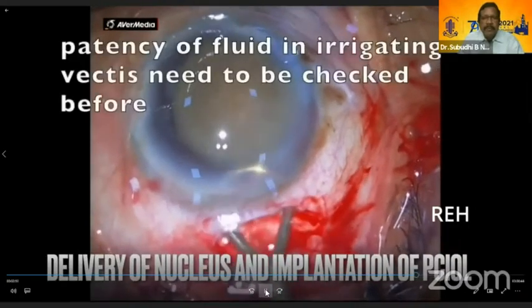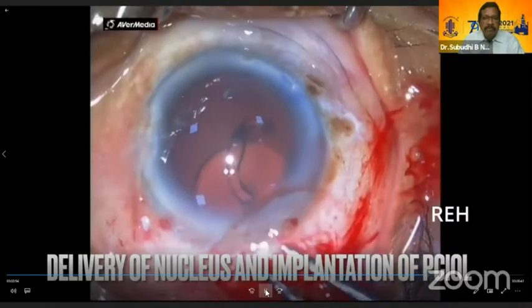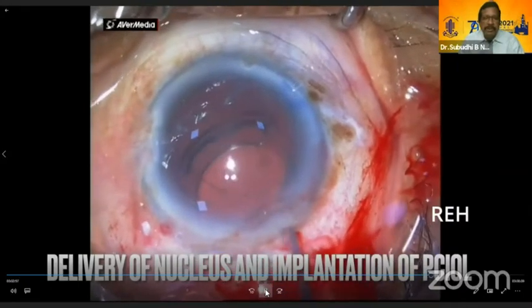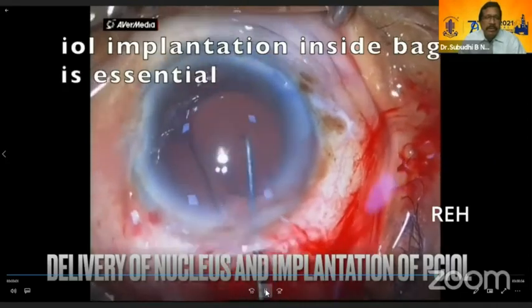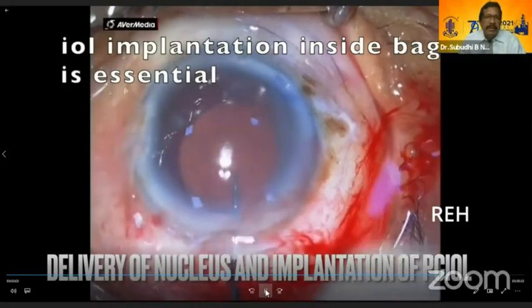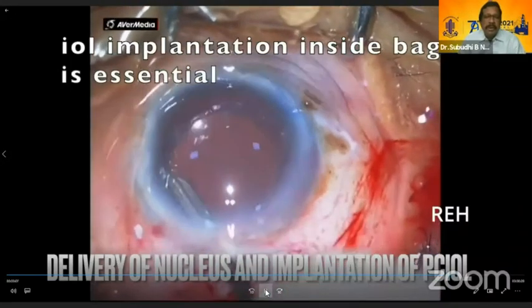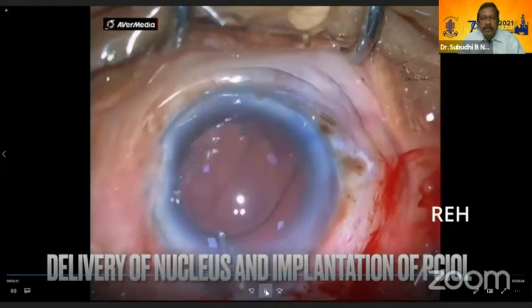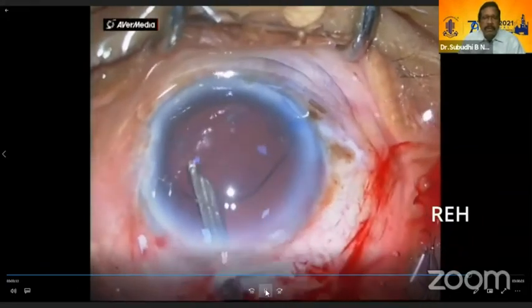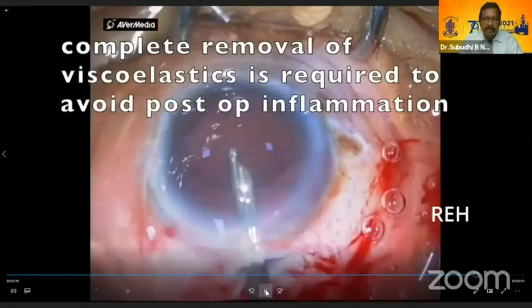Take the irrigating cannula, then take out. So now your choice. If you want a foldable lens, you can give. If you want a PMMA lens, you can give. So anything is good. See that it's well centered in the capsular bag. Just do some kind of dialing so that it goes in the capsular bag, and wash out all the viscoelastic from in front of the lens and behind the lens, so that it will not give post-op inflammation.